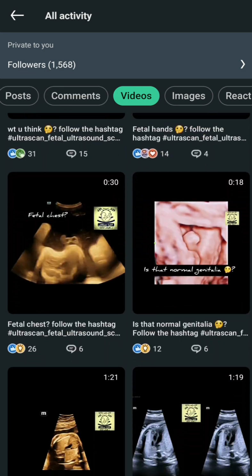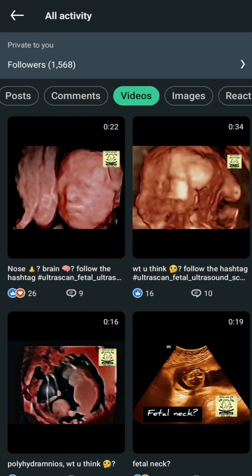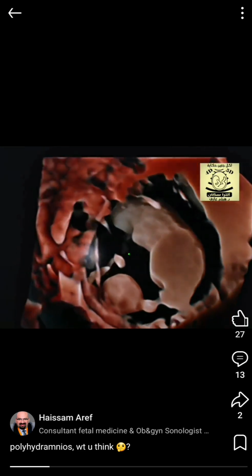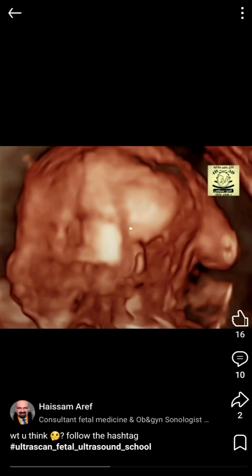My friends brought to my attention that there was a defect in the last week's cases. We did not discuss a case like this one, which was a case of, yes, we did not discuss the case of duodenal atresia, I guess, with this amazing render. Yes, it's a case of duodenal atresia, and this case was an encephalocele.